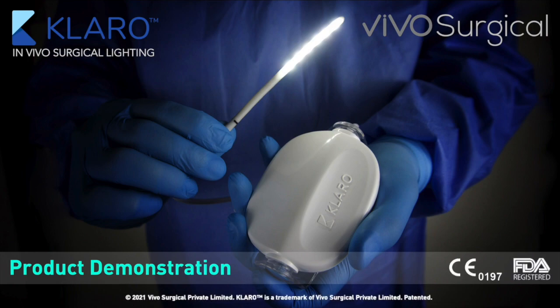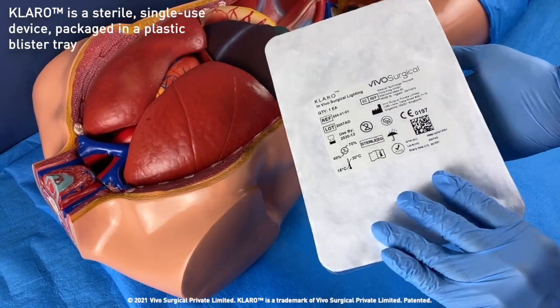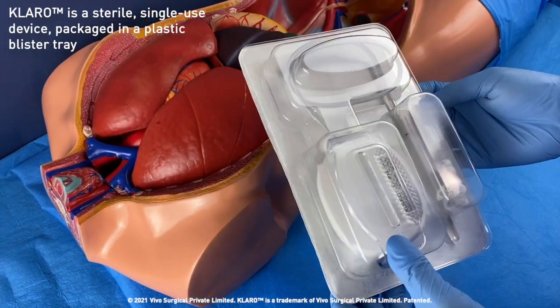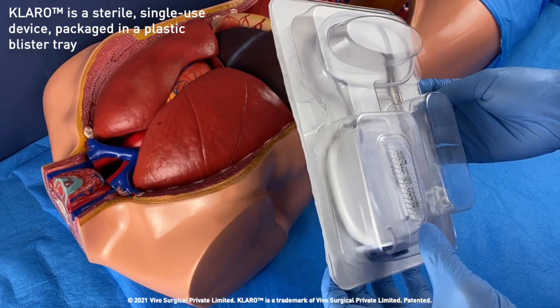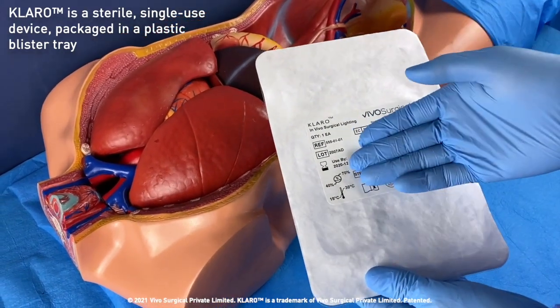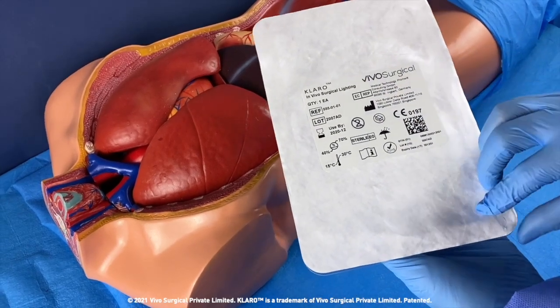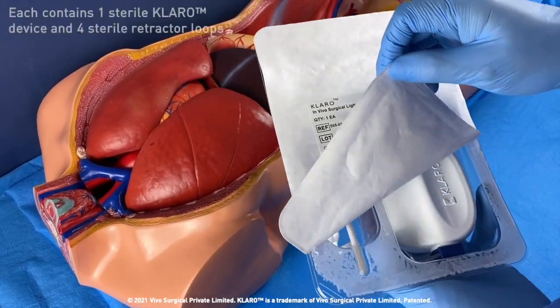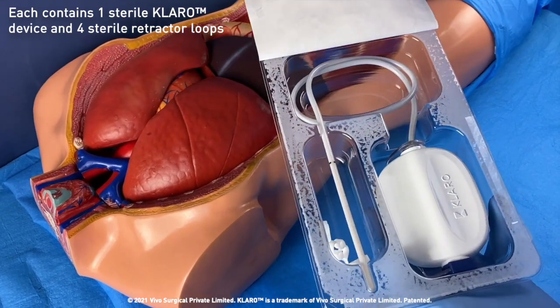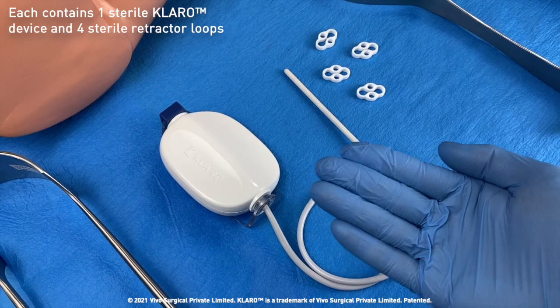Welcome to the Claro demonstration video. Claro in vivo surgical lighting is packaged fully sterile in a plastic blister tray. The top of the blister tray is labeled with key information such as the lot number and use by date. The blister tray is peeled open to reveal the sterile Claro device and four white retractor loops.